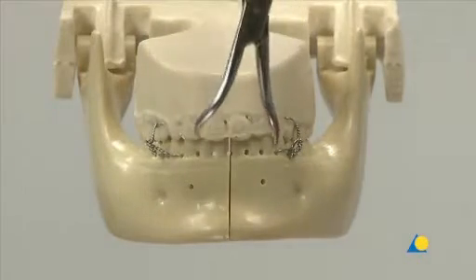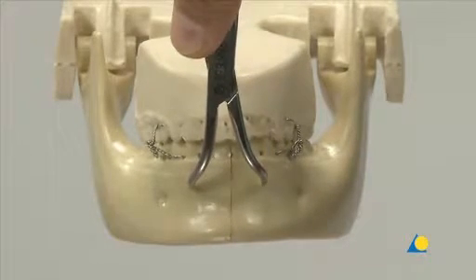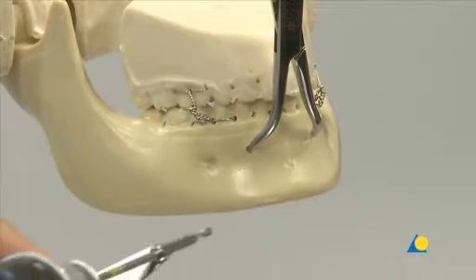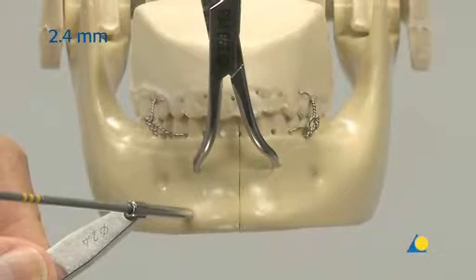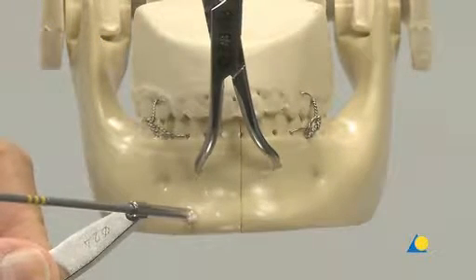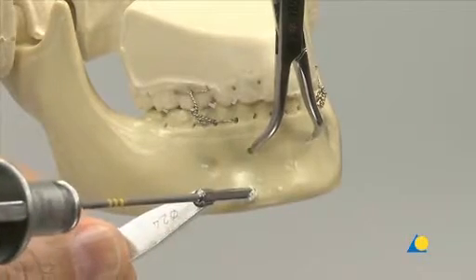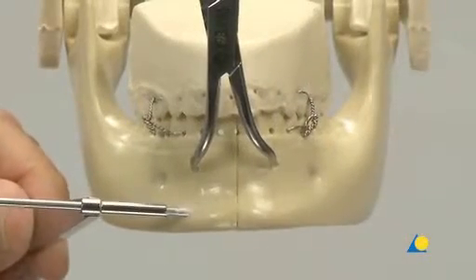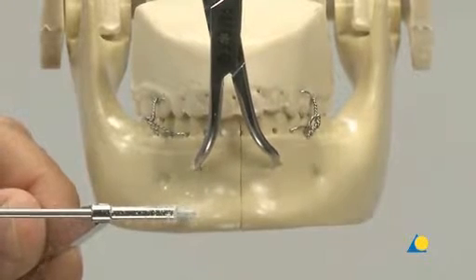The mandible halves are manipulated until anatomical reduction is achieved. The 2.4mm glide hole is made near the inferior border of the mandible in the canine region. The drill guide is placed perpendicular to the bone to avoid slippage, then redirected perpendicular to the fracture line. The drill path must not break through on the lingual cortex of the mandible.